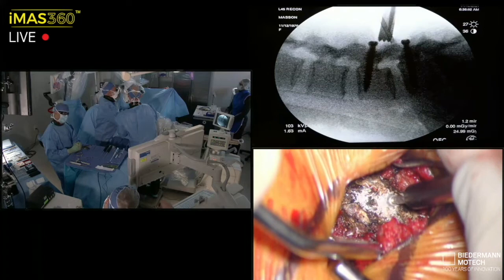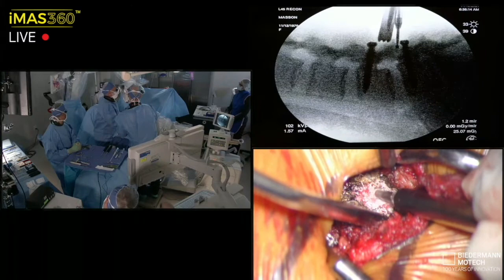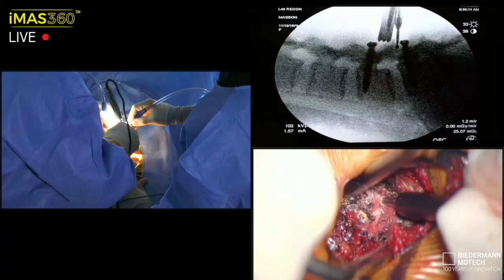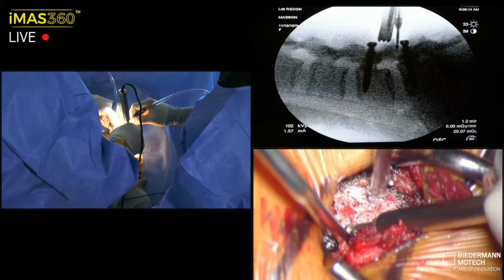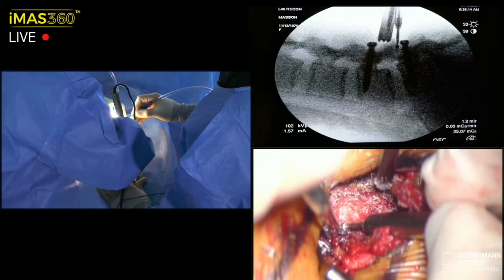So here's the pedicle. This is going to be my A-hole roughly, assuming I'm at superior end plate view, which I am. So I'm going to go, as always, A-hole up to B-hole, and mature that, and then go lateral, inferiorly from the A-hole, and then a trapezoidal cut, superior roof. We'll amputate the very prominent posterior facet at the same time as we deliver that. And then we'll do an oblique roof that'll be roughly parallel to where we expect that L4 nerve root to go.